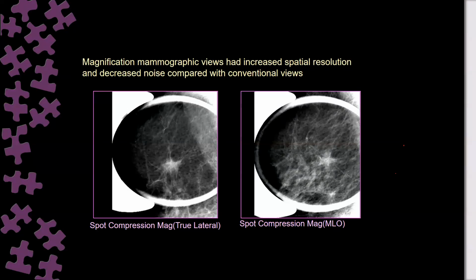Because the lesion is more lateral. Excellent. The lateral side. Because the lesion is laterally located in the outer breast. Excellent. Yeah, you won the case. Full prize.